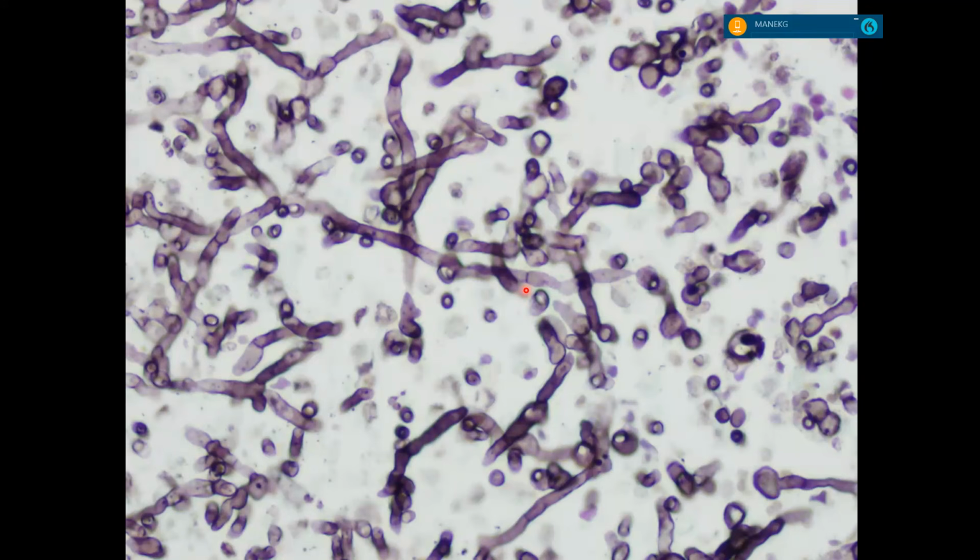Septated. Yeah, septa. Aspergillus. So for practical purposes, this is Aspergillus. But in real life, some other things can look like this: Pseudallescheria, Scedosporium, Fusarium can look like this, but in real life, Aspergillus is by far the most common like this. The other hyphae they might give you is Mucor.